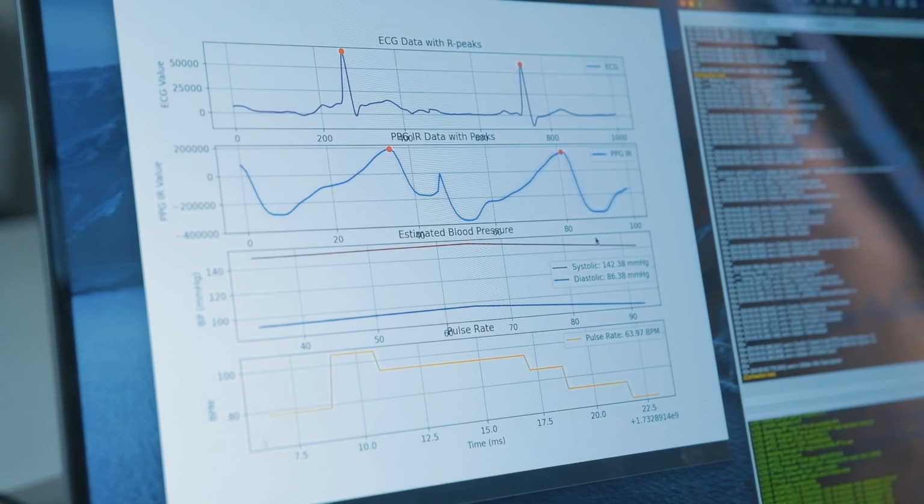The study of the heart is a complex procedure that requires data filtering to remove noise, advanced analysis, and sophisticated algorithms to process measurements accurately.